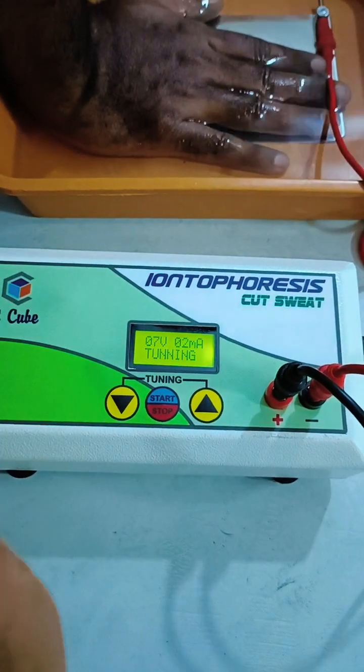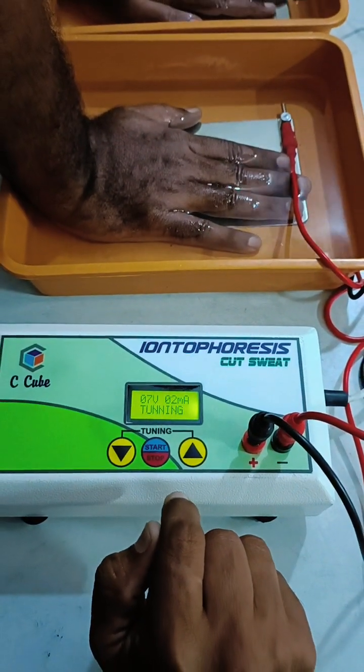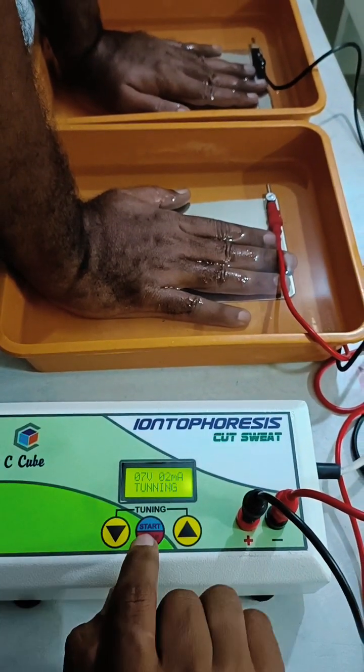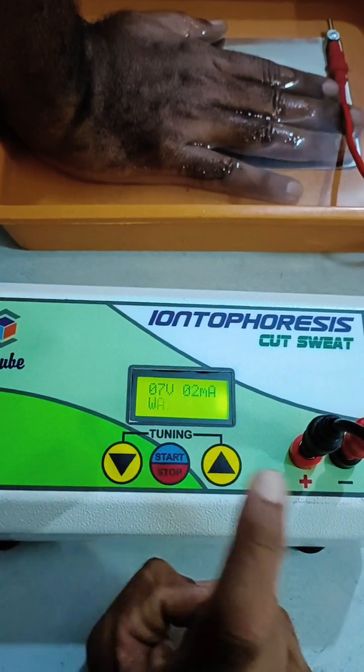The user is indicating that they are getting a tingling effect. This means the required amount of current and voltage is passing through for the treatment. I will now save these settings — 7 volts, 2 milliamps. Tuning is now completed and saved.